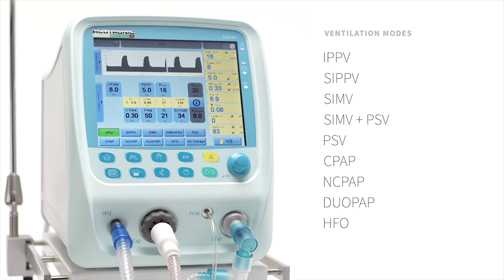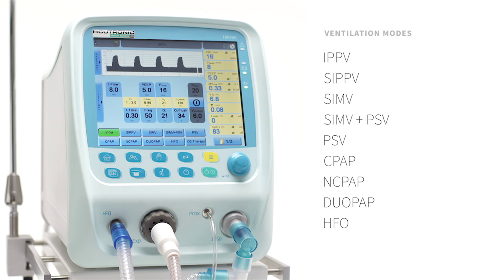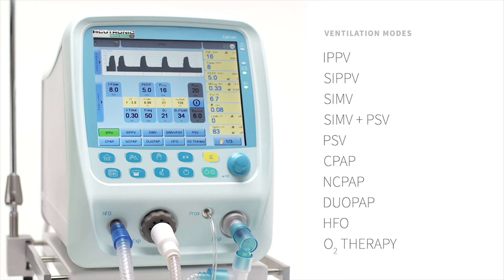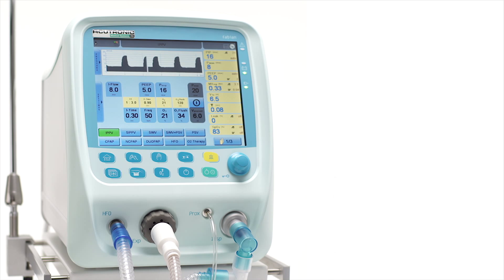HFO, High Frequency Oscillatory Ventilation with active in and expiration phase, using piston and membrane technology. O2 therapy — high or low flow oxygen therapy with nasal cannula, for instance RAM cannula or similar.